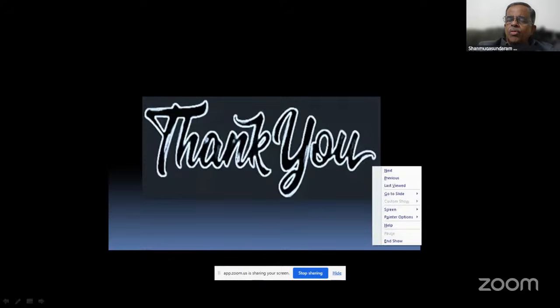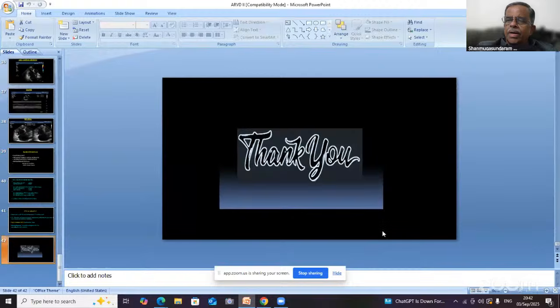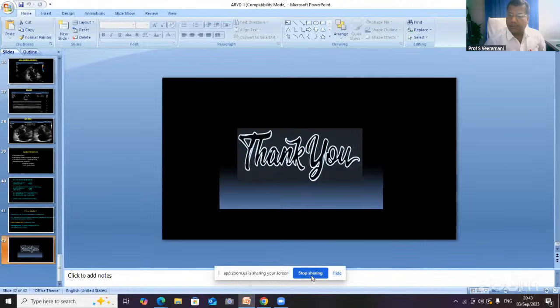I'm sure you would have done cardiac MRI for this patient. Yes, sir. Just tell the findings. In cardiac MRI, the RVOT dilatation and the apical aneurysm were demonstrated, sir. But here, we have only shown the echo; we didn't show the MRI.